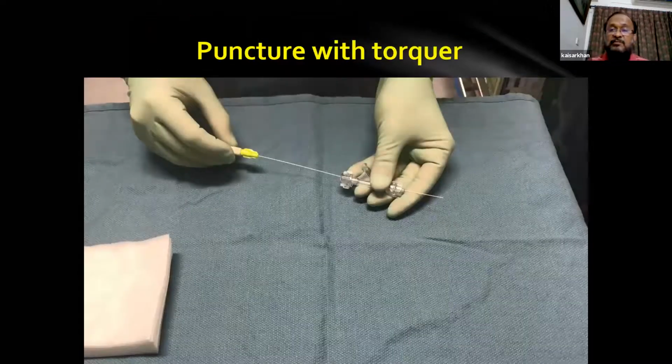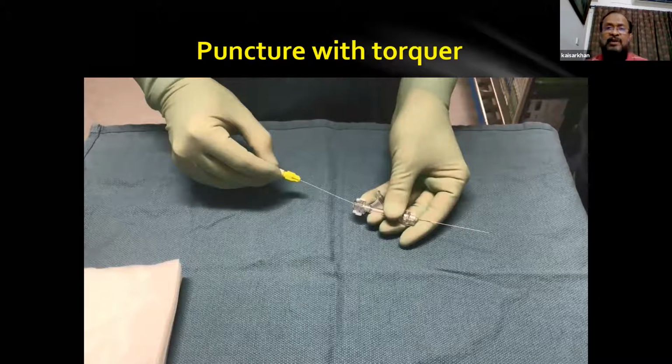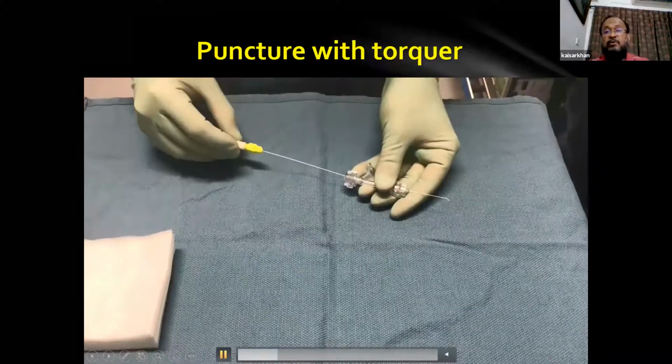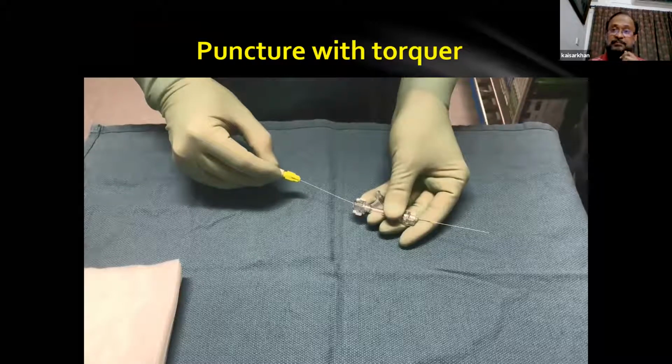Puncture with torquer. You can see the tip of the wire, it is just one bend, 2 millimeter from the tip, almost 45 degree. So you can use it with a harder wire like Conquest Pro 9 or 12. But you have to know the direction of your wire because it can easily perforate the artery as well.